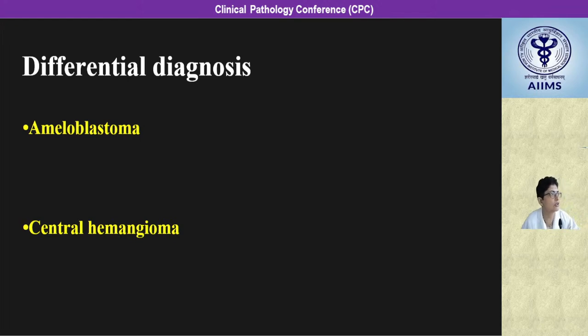Since it is a CBCT, we cannot really comment about the enhancement pattern or the soft tissue characterization of the lesion. So I think we have to keep both these differentials in mind when we are further evaluating the lesion. Thank you.